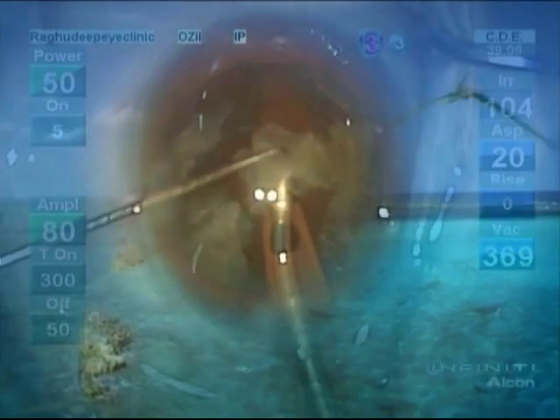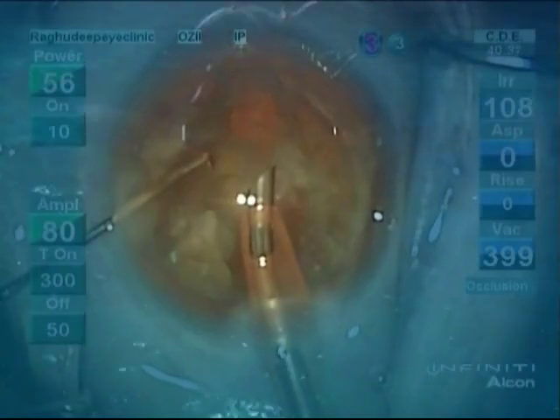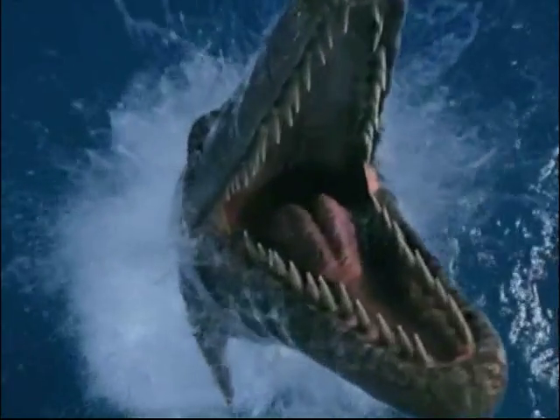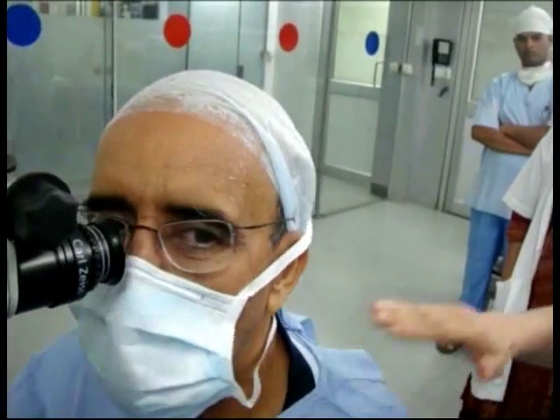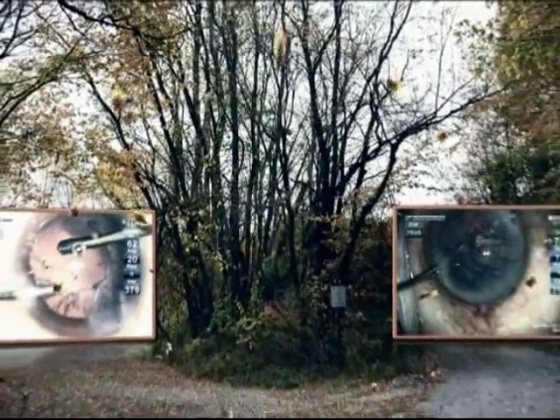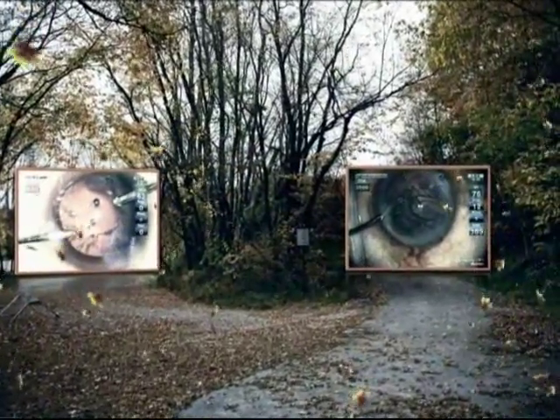Cataract surgeons are familiar with this situation, where there is smooth sailing of a routine cataract surgery until that dreaded moment when the vitreous is seen prolapsing through a posterior capsule rupture. From that moment on, our heart goes into overdrive and panic rules our mind. And here is where we decide which road to take in the management of this crisis.